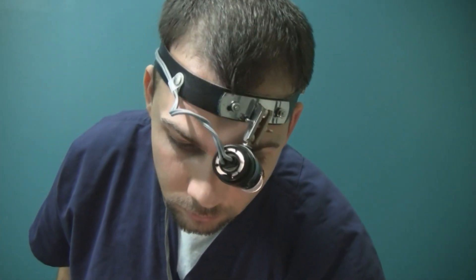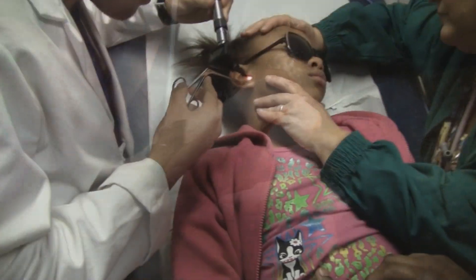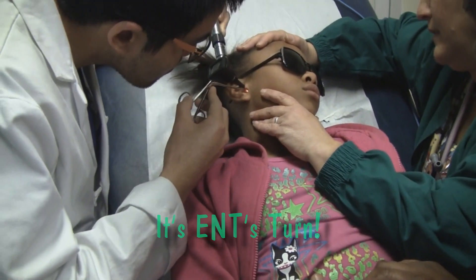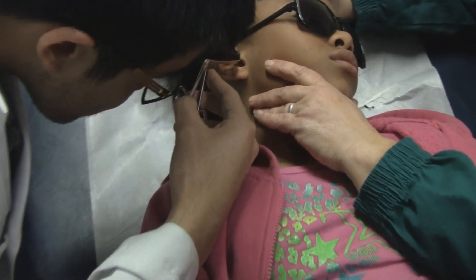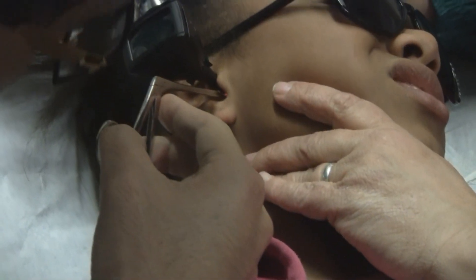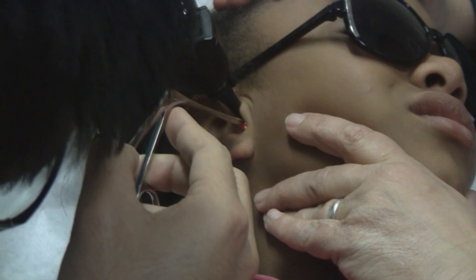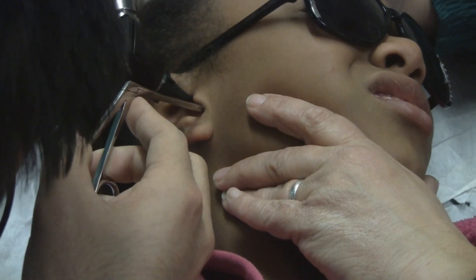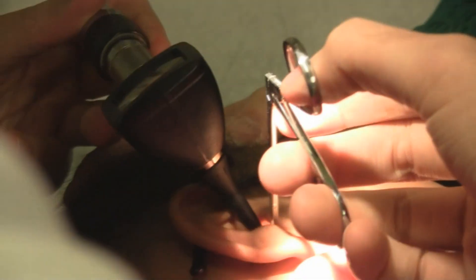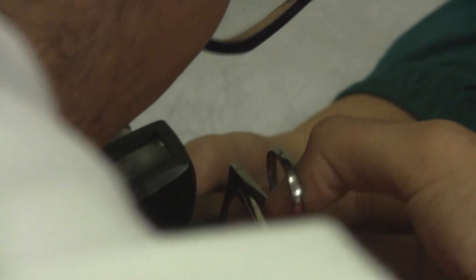What do you think if this doesn't work — ENT? ENT. Just be very still; they might feel funny. Think about something else — think about Thanksgiving and turkey. We're talking about what we're going to have for Thanksgiving dinner. Does she make gravy? Is it good? What about mashed potatoes?